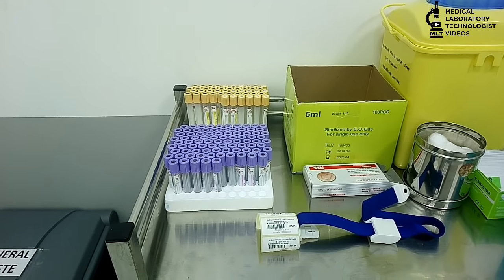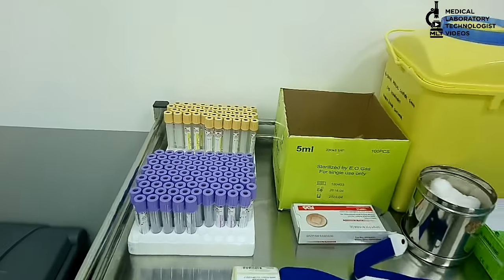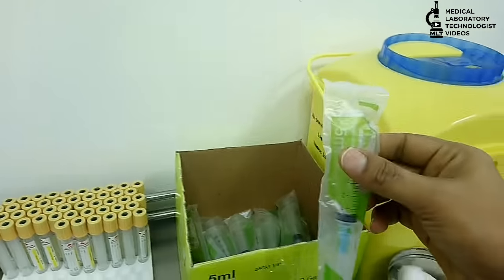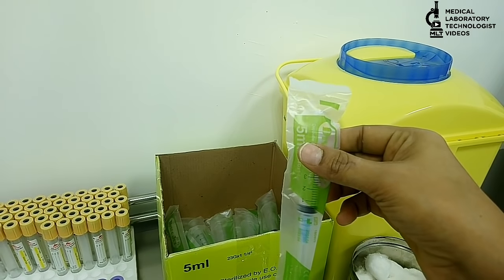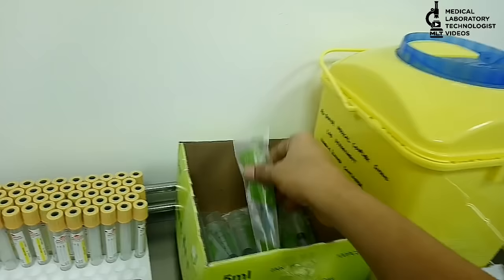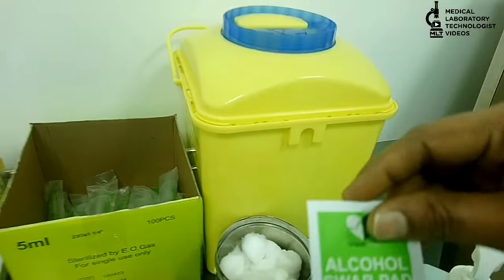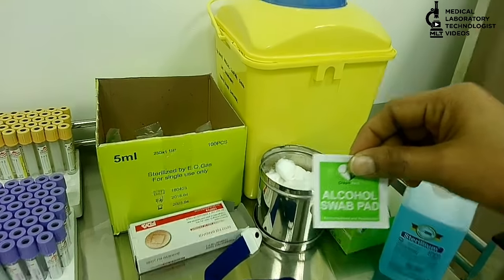Before that, I will show you what things are needed for this extraction. Syringes — always open the syringe in front of the patient, otherwise the patient will think you are using used syringes, so it is better to open them in front of the patient. Then, cotton ball. Then, alcohol swab. If alcohol swab is not available, you can use spirit.